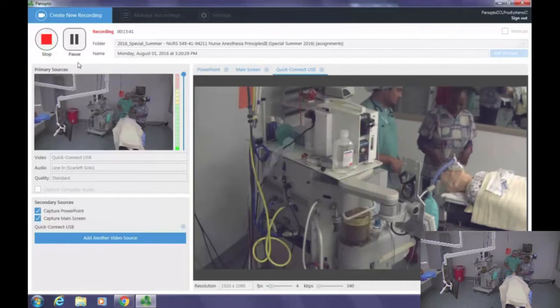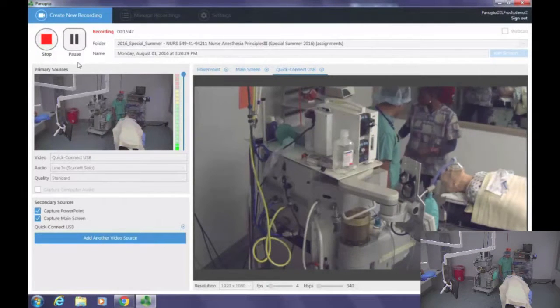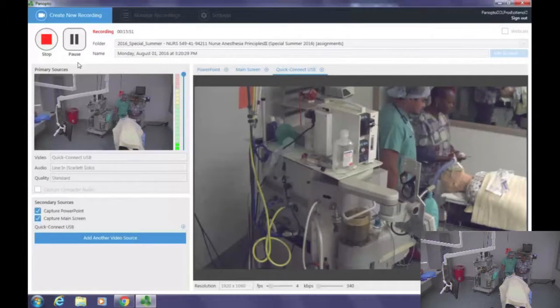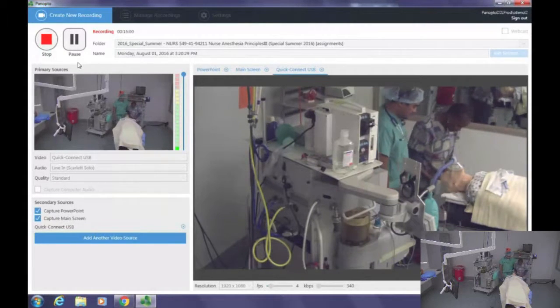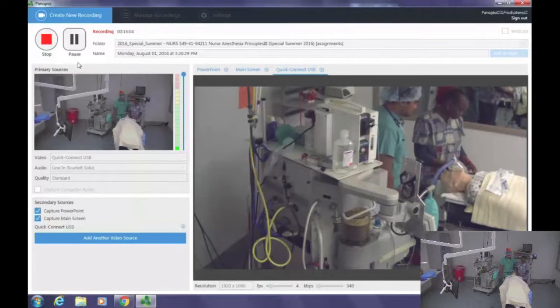Mr. Judy, we're going to go ahead and give you some medicine to take you to sleep, okay? I'll bring my medications. Remember, my medications were prepared beforehand. I have my induction medications and my emergency medications. This is the IV over here. I'm going to give my lidocaine, 80 milligrams.